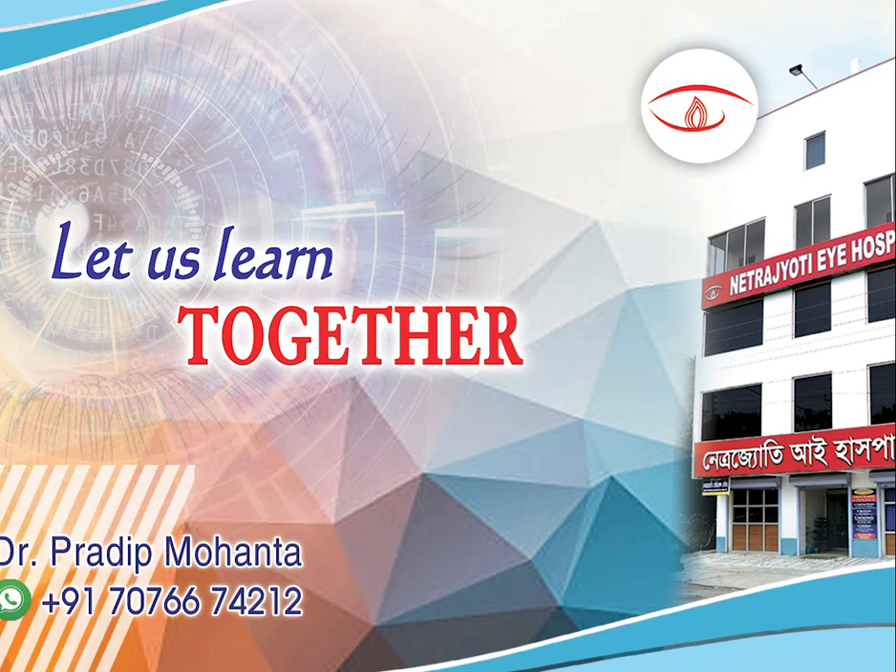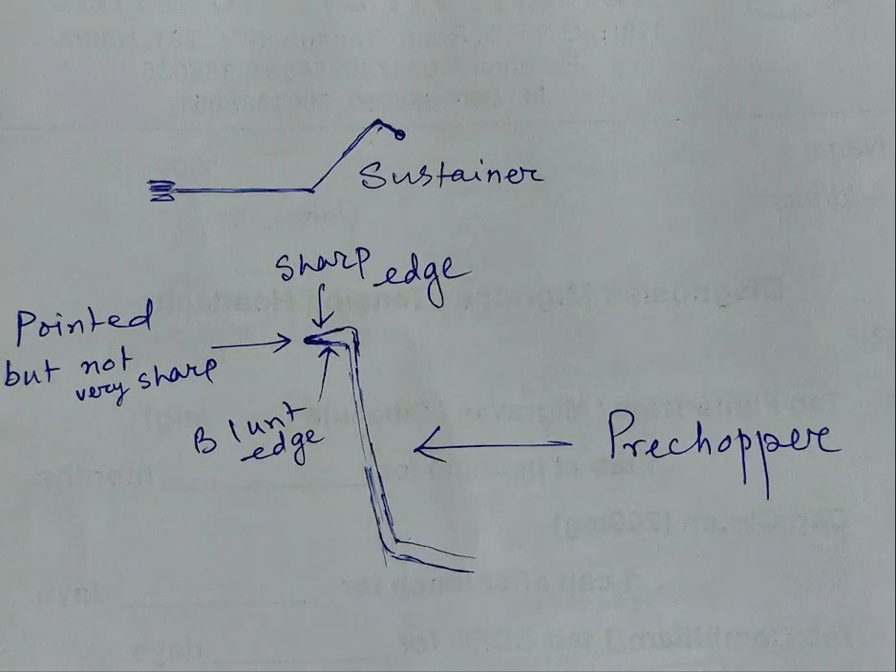Friends, what is a pre-chopper? A pre-chopper is an instrument that divides the nucleus into pieces before you use your phaco handpiece, and you use a sustainer along with that. This is my design — sharp edge in front and blunt edge in the back. There is a sustainer with a ball tip, and with these two instruments, we can divide the soft nuclei very easily into pieces.